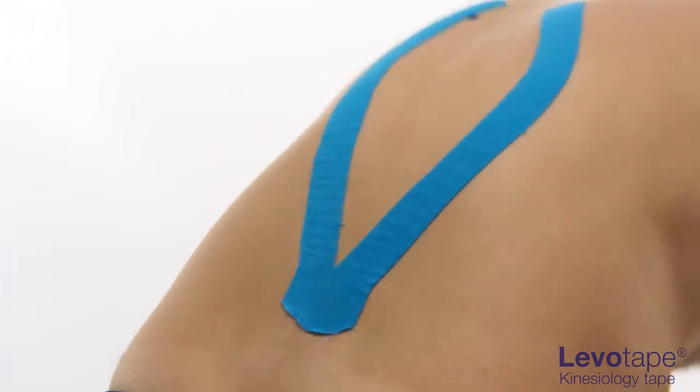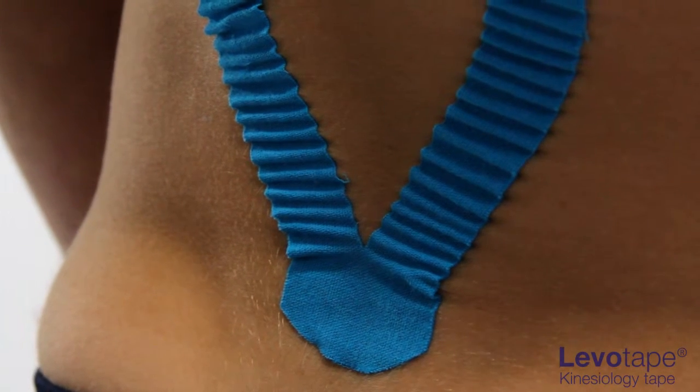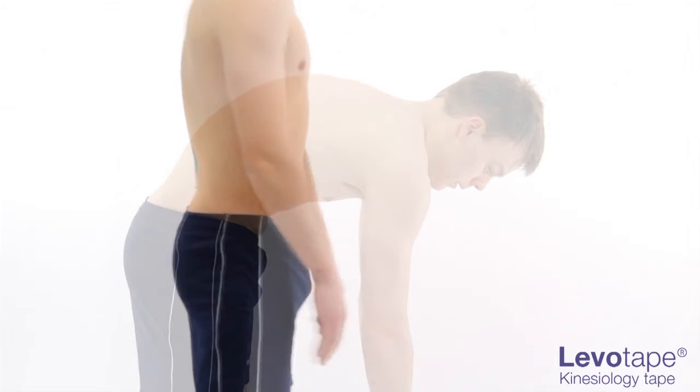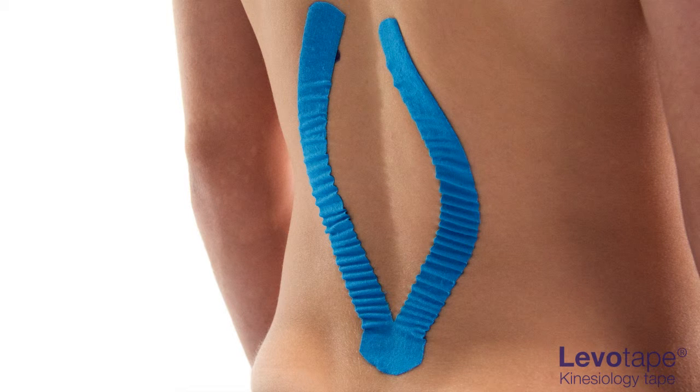Return the patient to neutral and look for convolutions. The patient should experience a greater degree of flexion and localised pain reduction. If the patient does not experience a relief of symptoms, check that the tape has been correctly applied or reconsider the chosen technique.